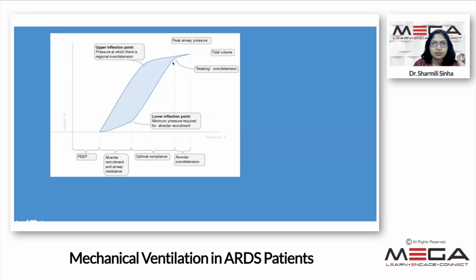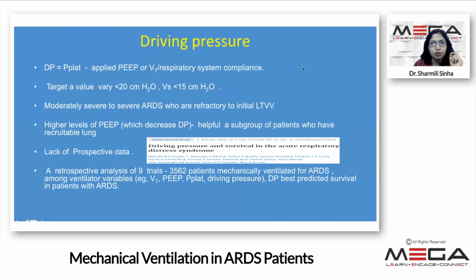This is just a pressure volume curve. Here, Dr. Ranajit has already shown this. So somewhere between this point and this point, you can keep the PEEP. If you are good at studying your ventilator graphics, which you will be after this webinar series, I believe, then you can keep the PEEP somewhere between this and this point and monitor the patients, because ultimately, it is you, the clinician, and the patient who are going to determine the course of the ventilation, not the machine per se. So your monitoring and assessment has a very important role to play in this patient.